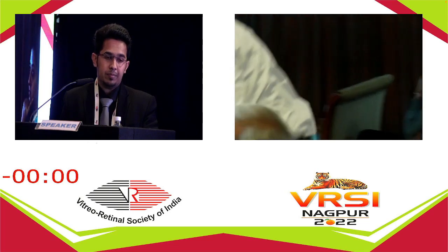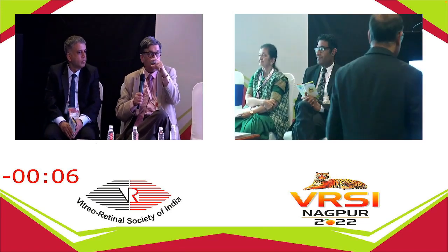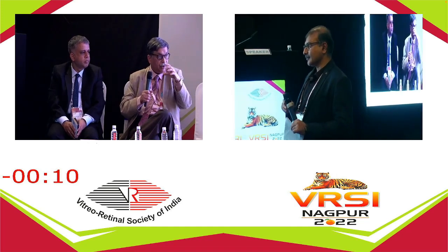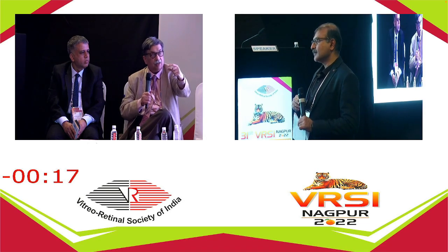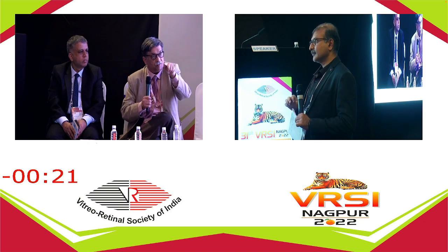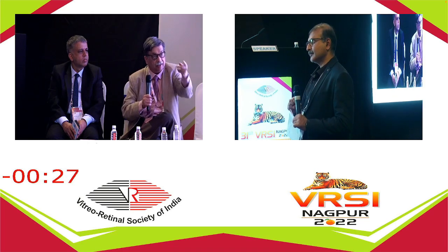Pulsed. I just wanted to say that when you do this kind of laser, there must be a broad band of laser. You just don't do two rows. You do a broad band, and as Madam said, as the blood clears off, if you see there's more space between the edge of the tear and the area which is lasered, you go inside and do more laser. So that finally you've got the edge covered too. That is what prevents the subsequent detachment in that area.